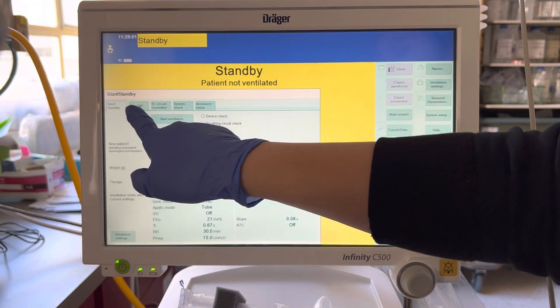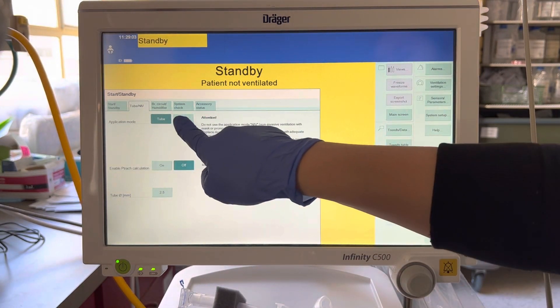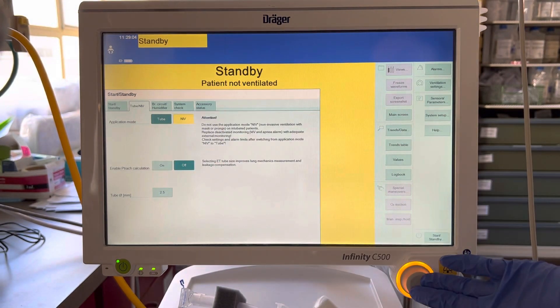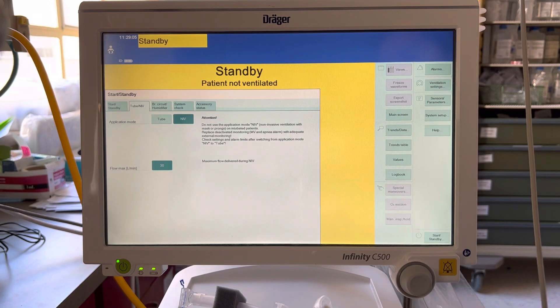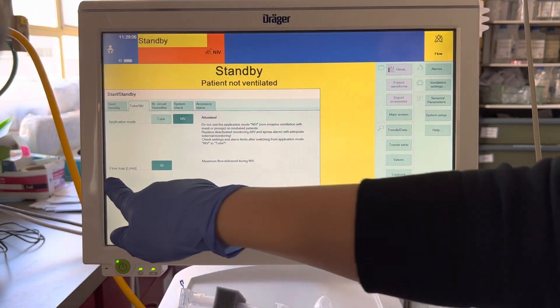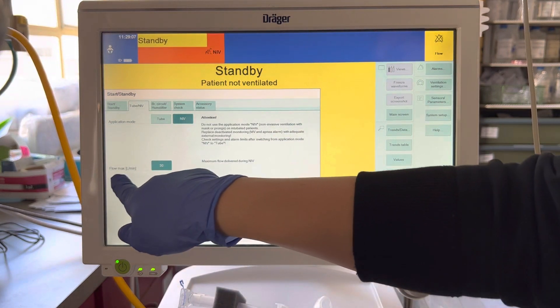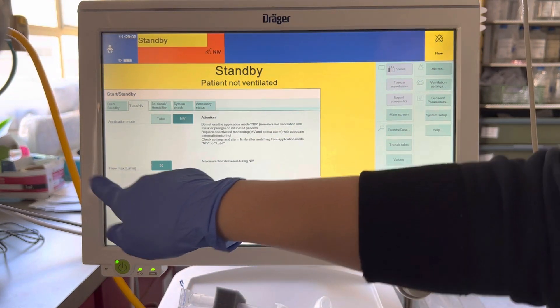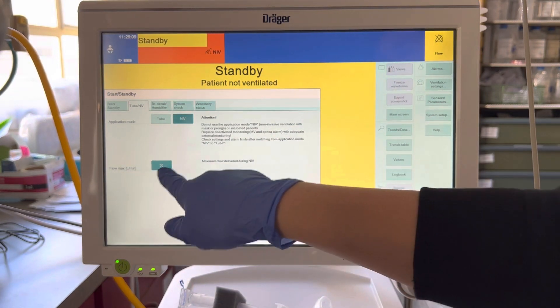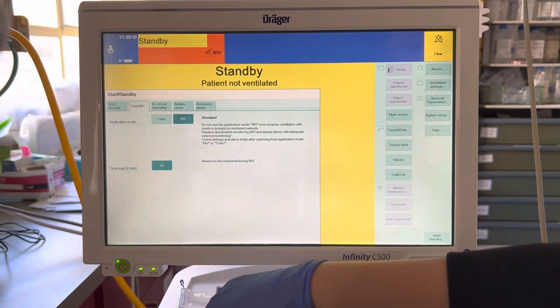Now you're going to go to the tube and NIV tab. Press that, press NIV, confirm. In yellow it's going to show you flex mode, flow max — it's just going to be set at 30.